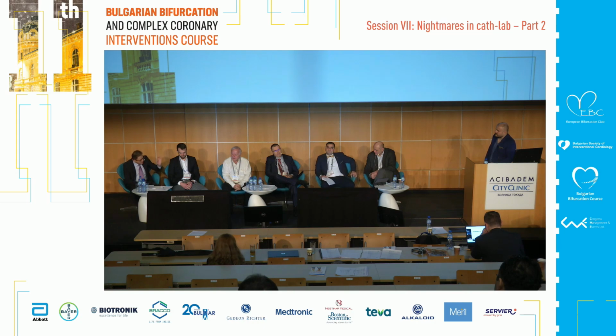Looking at the very fast pullback, I saw quite a good lumen. So personally, I would leave it because, as I told you, the antiproliferative action of the stent was already in place. So maybe this is also the moment to use such a situation, not to put another one.